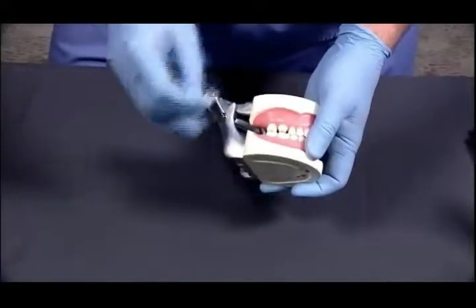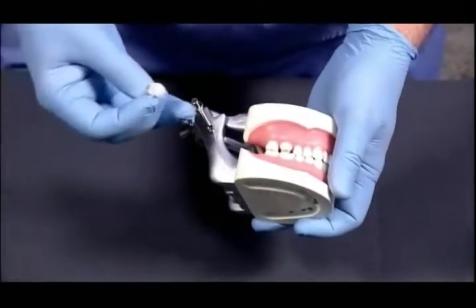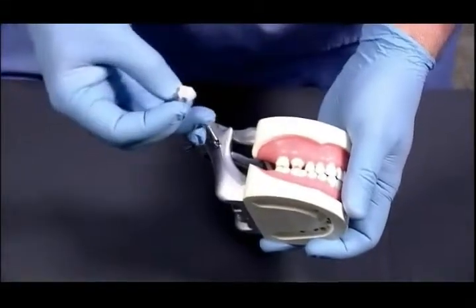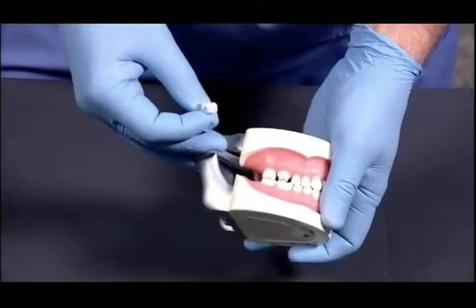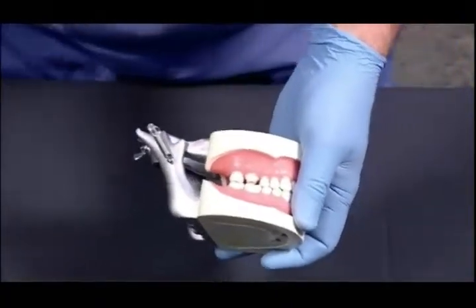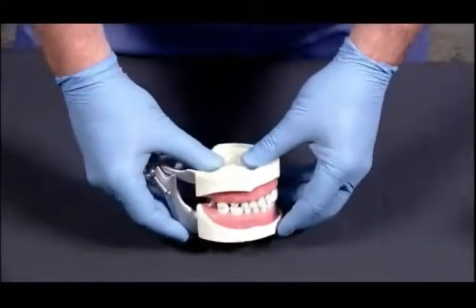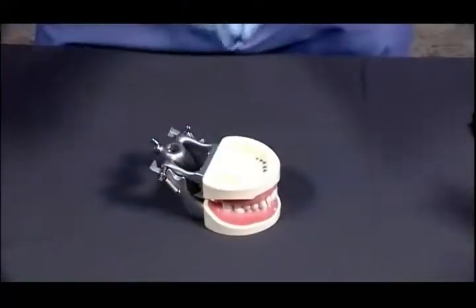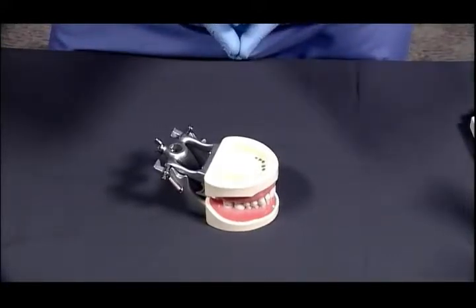But we'll get started from the point where you would have the patient in, they're already numbed up, and the preparation is done. And now you're going to be doing the actual procedure, fabricating the crown. The first thing that we would do is, as a team, we get a very good impression utilizing an alginate impression and a hydrocolloid wash in this particular instance.